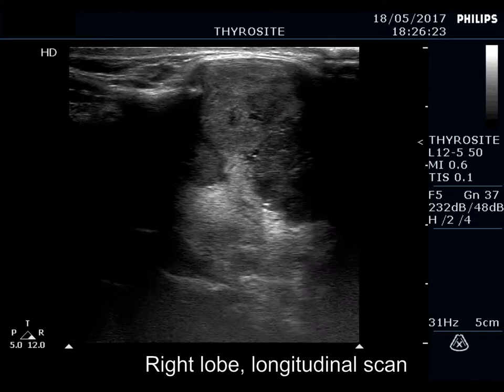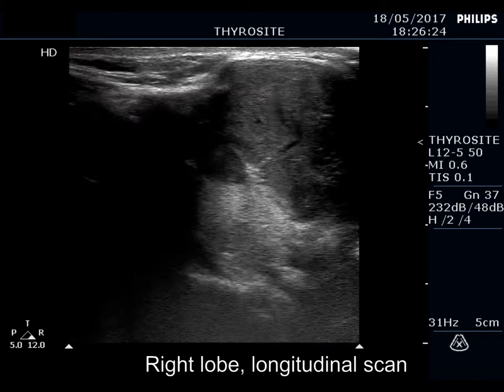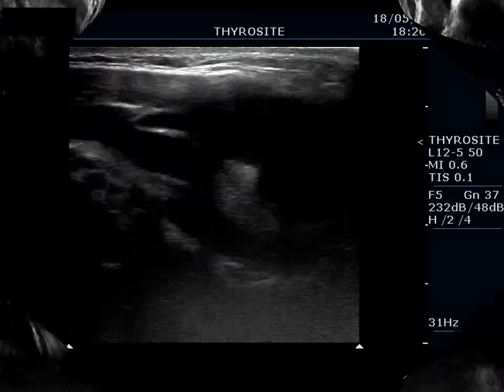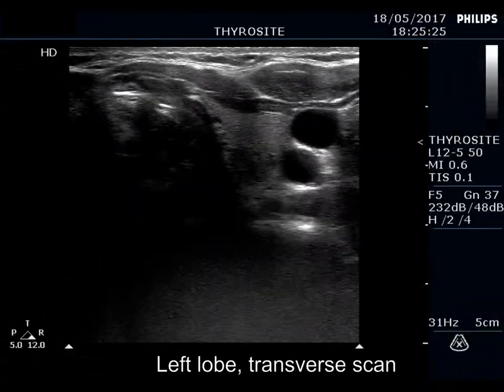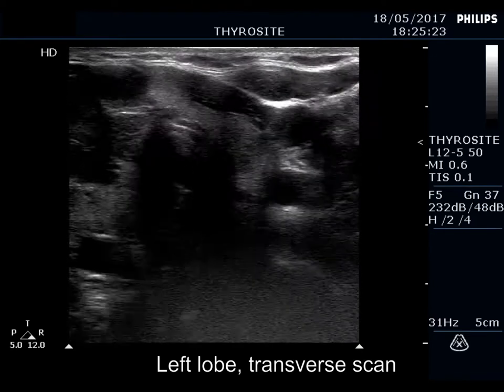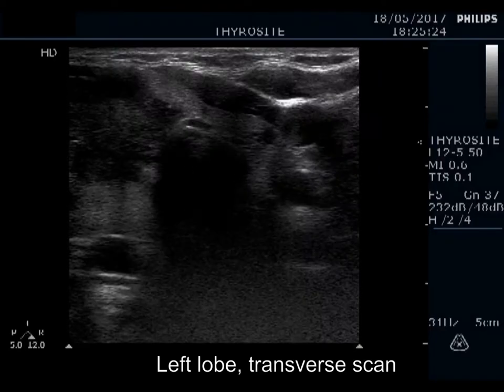The lesion presents microcalcifications. It is worth comparing the most ventral part of the right and the left lobe.